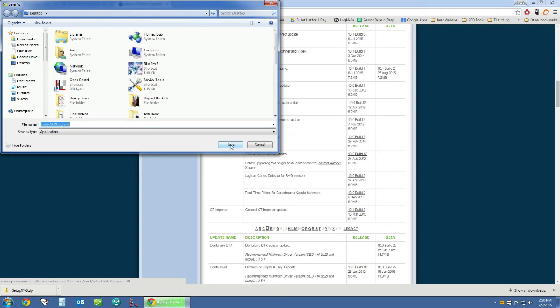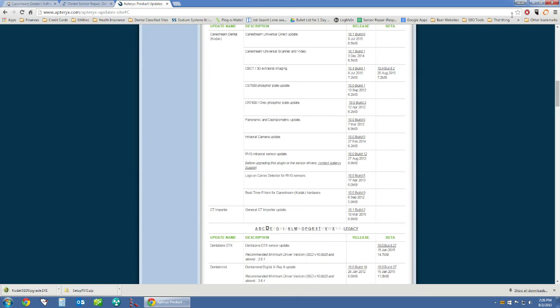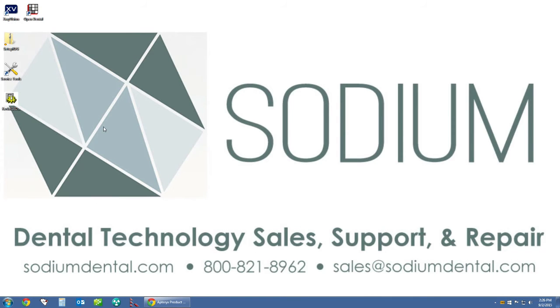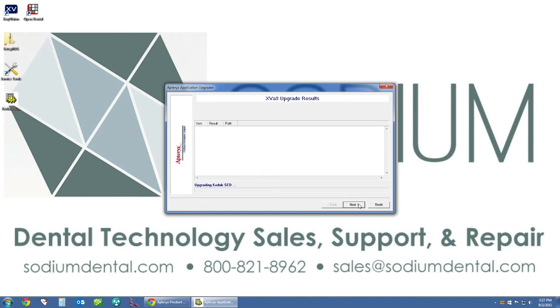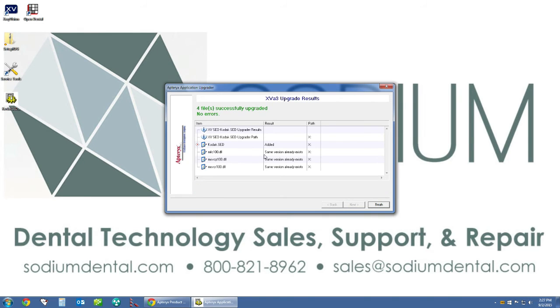This will download the Kodak upgrader to your computer — it should be a pretty quick download as the file is fairly small. Before running the Kodak updater for the X-Ray Vision software, make sure that X-Ray Vision is closed on all workstations. Go around all of your workstations as well as your data server and confirm that X-Ray Vision is closed. Once confirmed, double-click the upgrader and run it, then click next. This will add all the files needed for our Kodak sensor to work in X-Ray Vision.